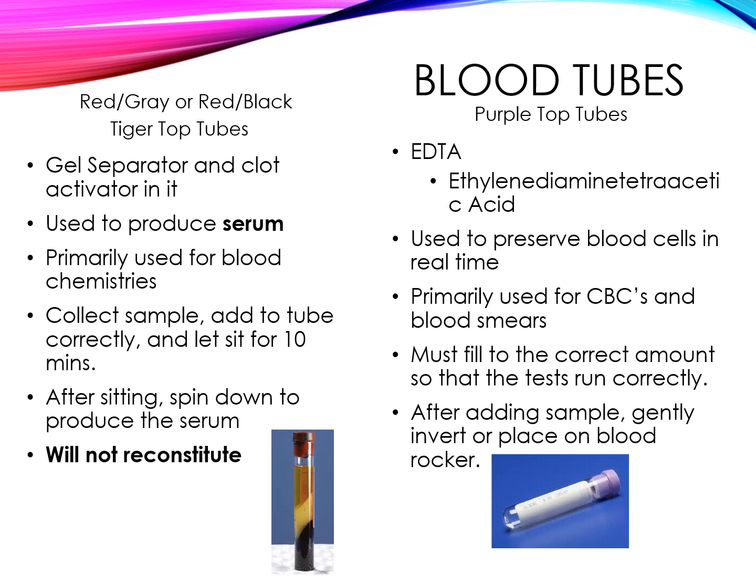Another important thing to note about serum separators is that if you leave the blood clotted and do not centrifuge it down for some time, the glucose will start to deteriorate in the tube. So the glucose level will go down as much as 10% per hour that a serum separator tube is not centrifuged and separated. To the right, we have the EDTA tubes.